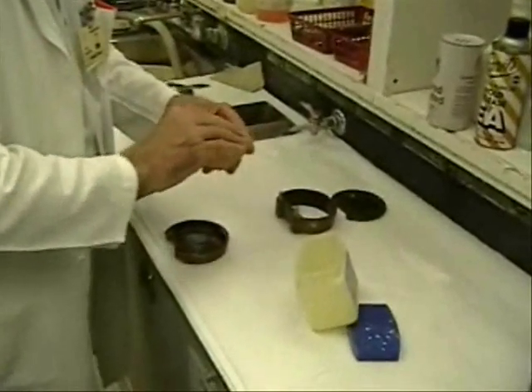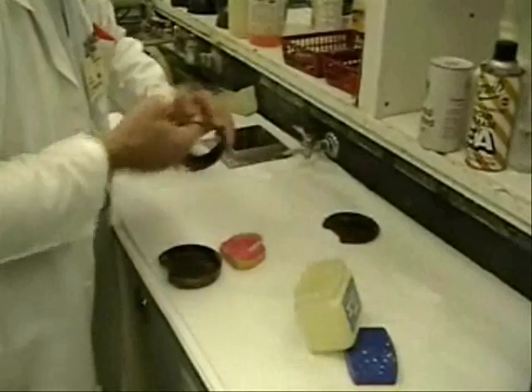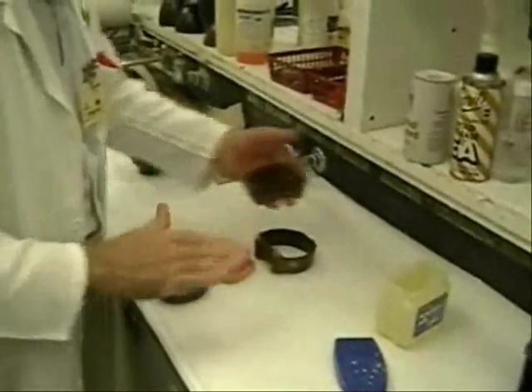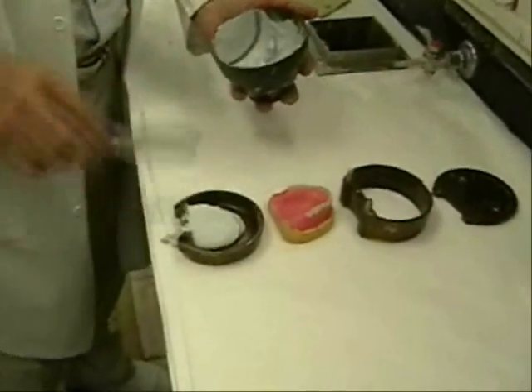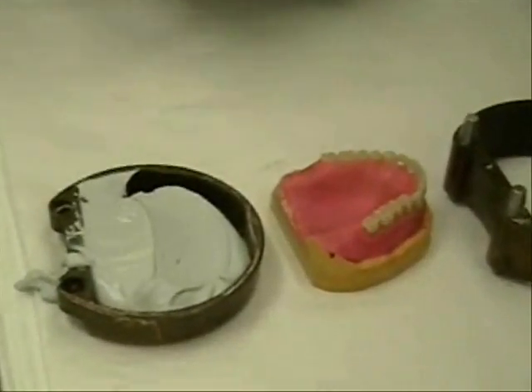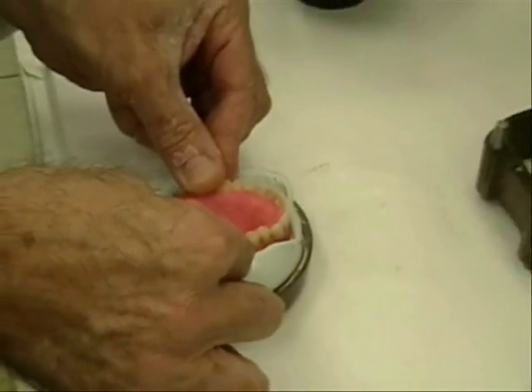The trial dentures are removed from the articulator and prepared for flasking. The process of flasking will create a split mold.